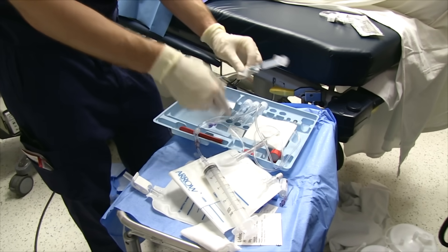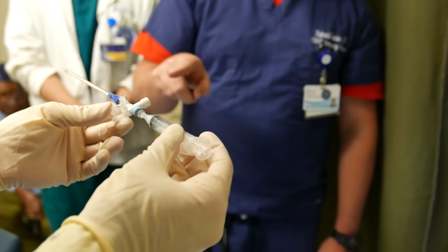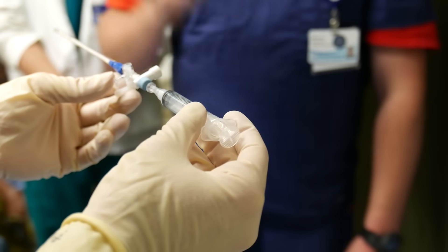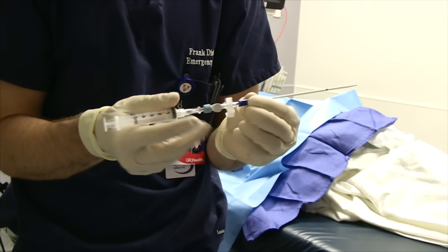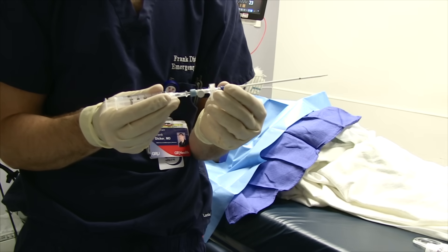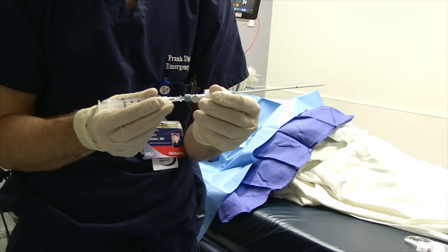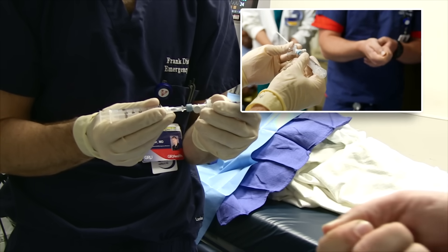Let's pull out our pigtail catheter. We've already anesthetized the patient. This is our pigtail catheter with introducing needle — it comes pre-attached to a 5 mL syringe in this kit. It's got a plastic sheath on the outside that you'll need to take off. Hold it down at the end — remember we're about two and a half centimeters before we get fluid. That mark is about two centimeters, so you should be getting fluid about the time you reach that mark.